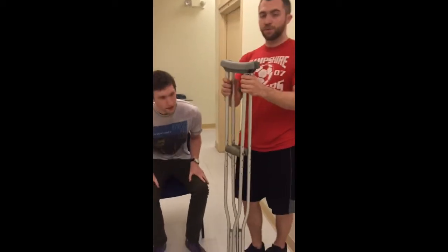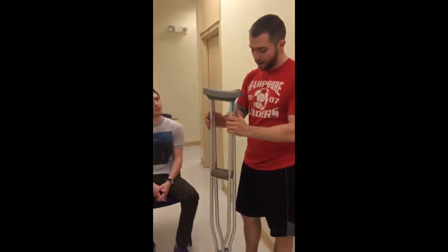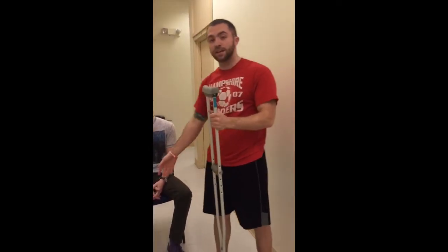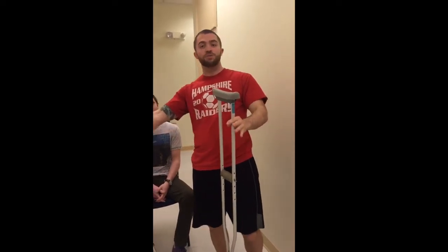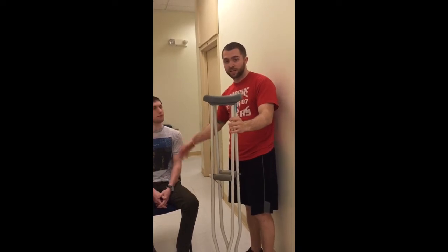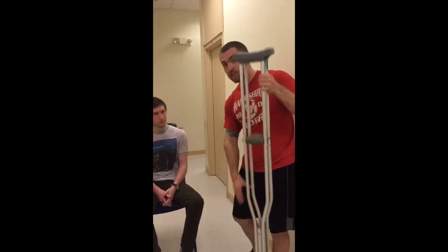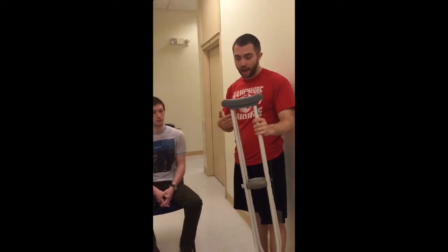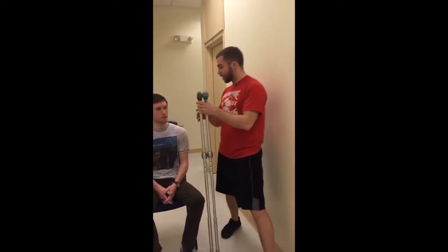So it's very important when measuring and refitting. Say I had to change these, I would change them, have Will stand up, and refit again. So always refit. You always want to check and recheck just to make sure that the assistive device is at the correct height. So I change these, I put them at a different height, I make them shorter or taller depending on what I had to do. And I'm going to have Will stand back up.